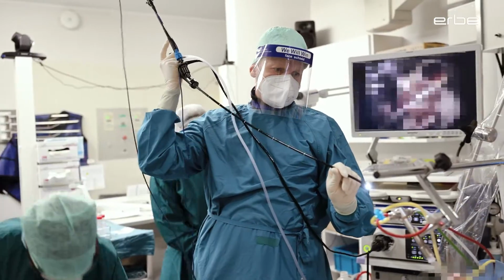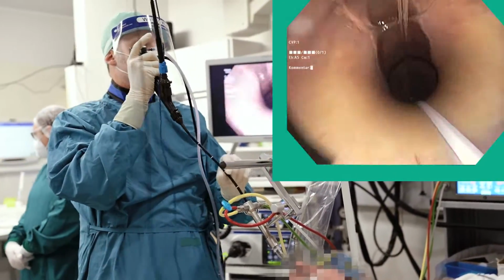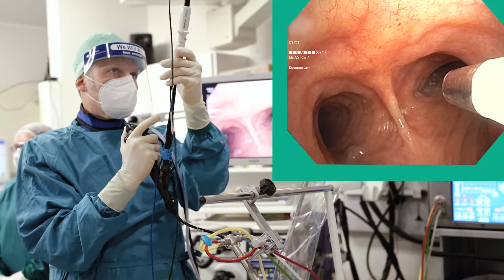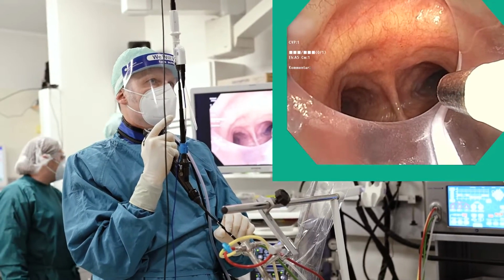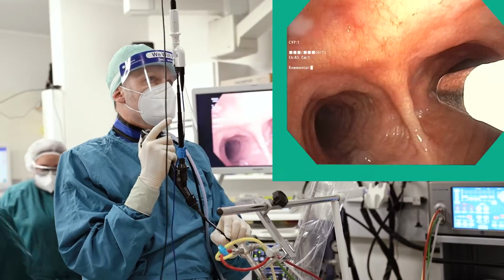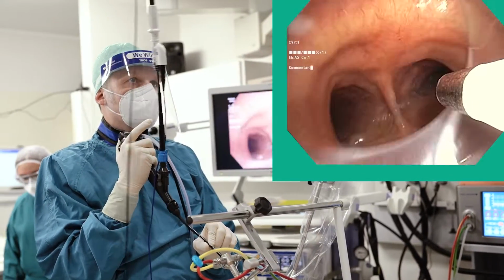The bronchoscope is then inserted for airway inspection. The patient undergoes fiber optic orotracheal intubation with the flexible ET tube after sufficient pre-oxygenation and induction of general anesthesia. The ET tube is mounted to a dedicated holder to prevent dislodgement. An adapter is connected for jet ventilation and bronchoscopy in parallel.